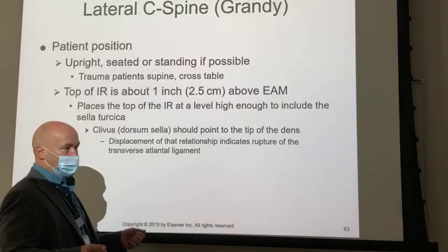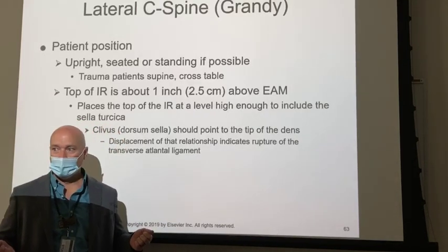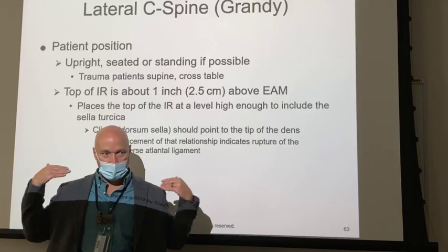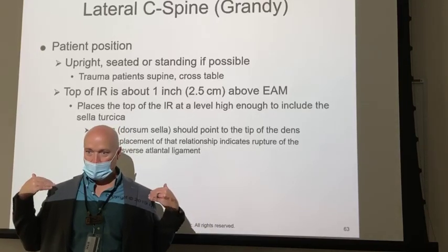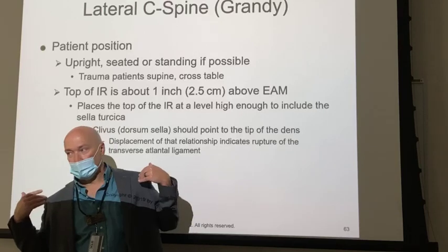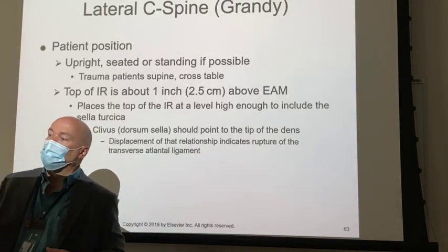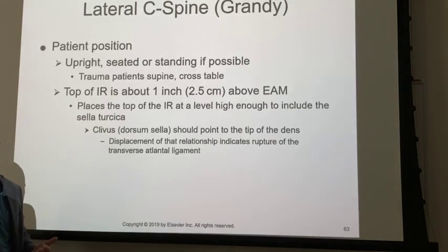So if you have one person pulling real hard and one person not pulling very hard at all, then instead of both shoulders coming down equally, one comes down and you twist the patient a little bit, and the other one, relatively speaking, goes up, which is going to get you less of the C-spine than having a single person pull. Okay?